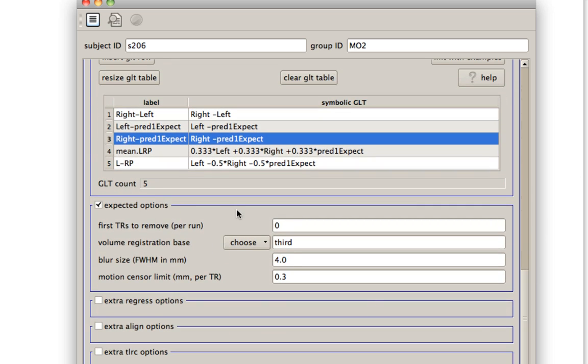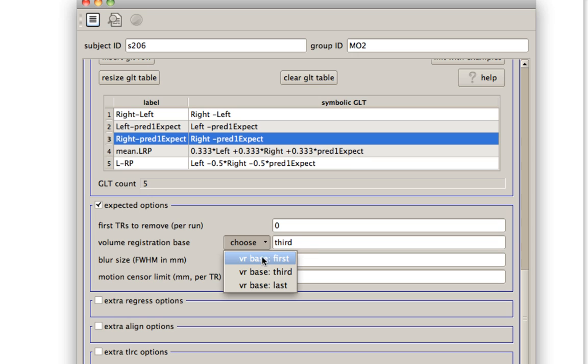So some further options for things like smoothing, for things like co-registration. Usually, my scanner at least, it removes the first two TRs automatically. So the first two volumes are automatically discarded. So usually I don't remove any TRs. And I do volume registration to the very first volume.